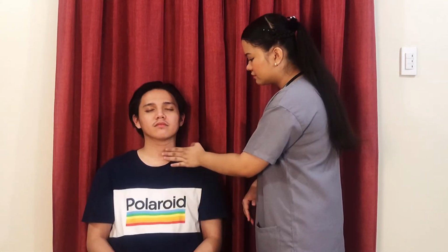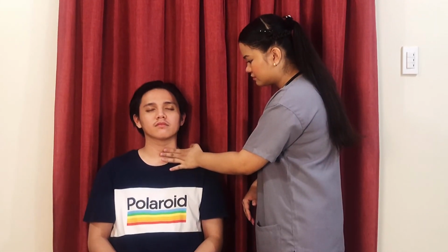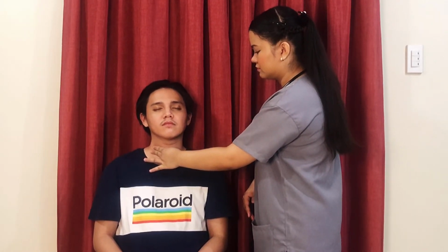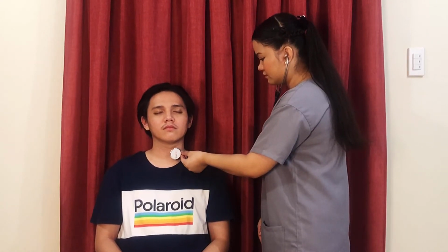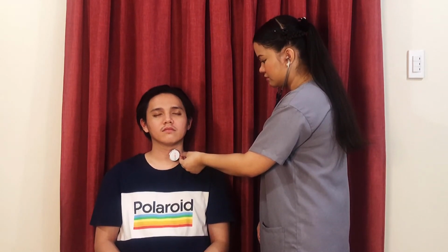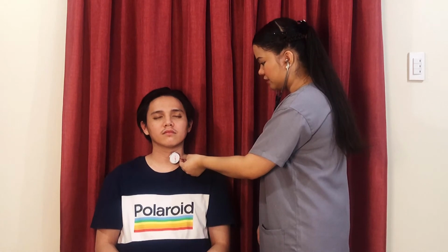Next, I will be going to inspect and palpate the left and then the right carotid artery of my patient. And then I will use the bell of my stethoscope to auscultate it. Do you feel anything, sir?